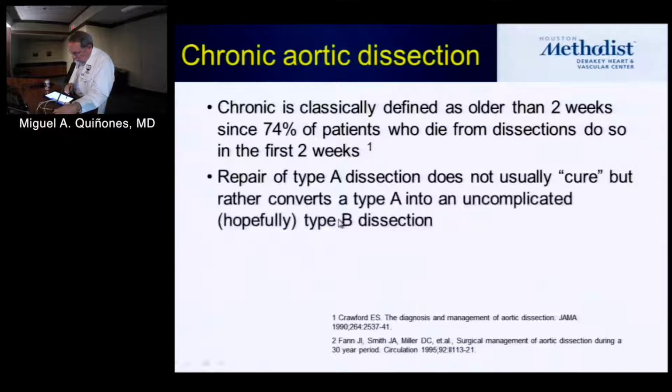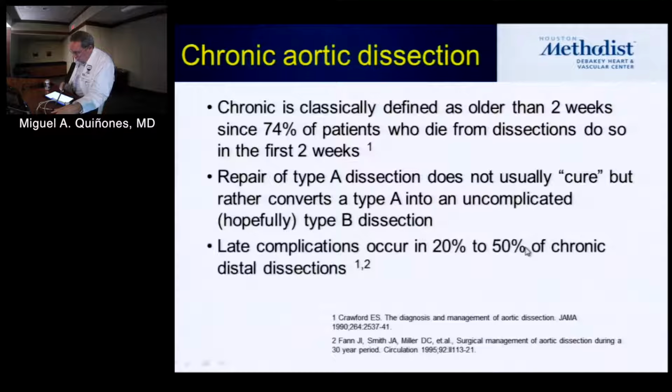You're now following the aorta for late events, where what you're interested in is progressive sizing of the descending aorta with the dissection, including the false lumen, to see if there is false lumen expansion or false lumen healing. So as you follow patients, initially you're going to see them every 3 or 4 months, then perhaps later every 6, perhaps eventually. I have a lady I've been seeing for 20 years. She gets now a CMR every 2 years because she's been so stable.